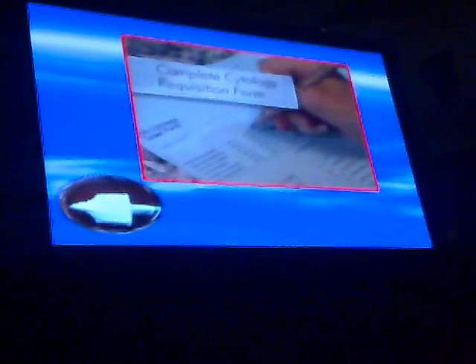Record the patient's name and identification number on the preservative solution vial. Record the patient information and medical history on the standard cytology requisition form used by your laboratory.